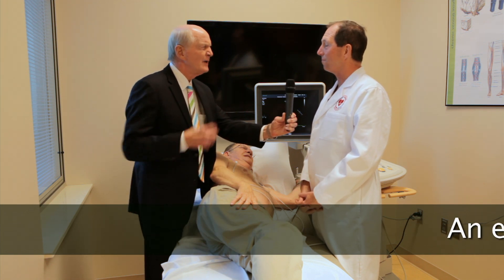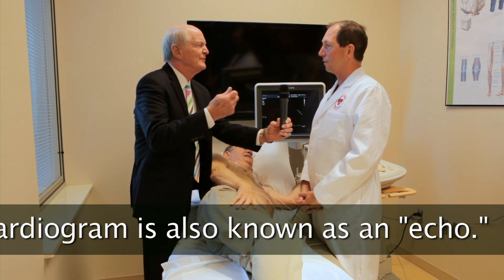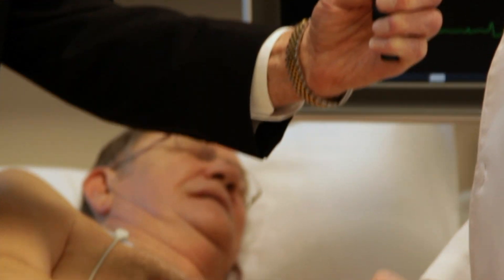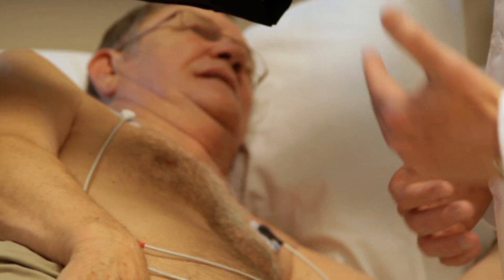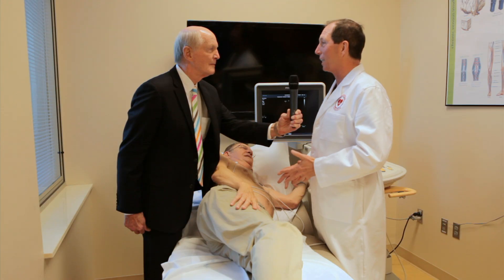Yes, very, very important. Can you tell if there's a weak valve, a leaky valve, or a valve that's not letting blood go through it — a stenotic valve? That's right. We can see both, and we can determine how severe — mild, moderate, or severe stenosis or regurgitation, a sticky valve or a leaky valve.